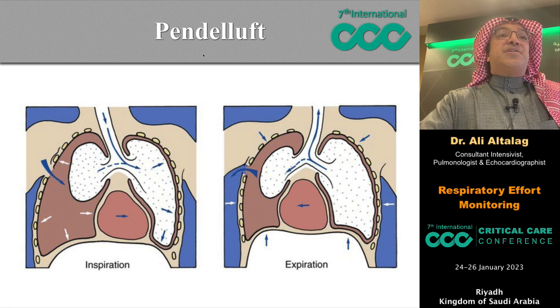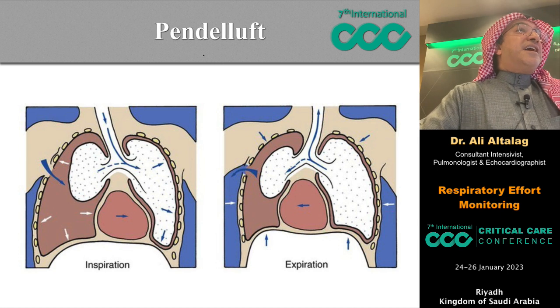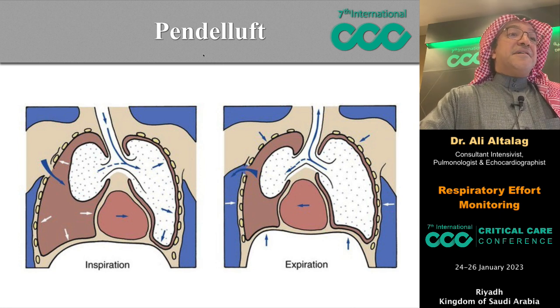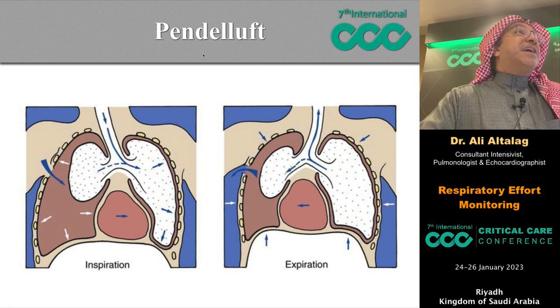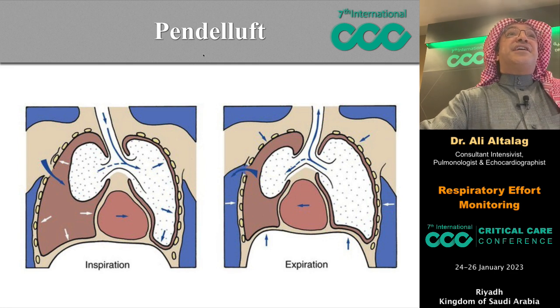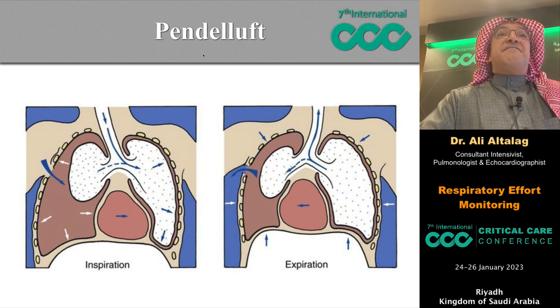Before I go further to the mechanism of the assisted ventilation-induced injuries, I'd like just to clarify a very important concept, which is Pendelluft. Now, after a tidal breath is delivered with all of its consequences to the lung, there's something else that happens inside the lung. There's movement of air from certain areas of the lung to other areas, depending on the mechanics of that particular area. And this by itself can cause injury. It happens also during exhalation and after exhalation with assisted ventilation. So it may be as injurious to the lung as the VILI.